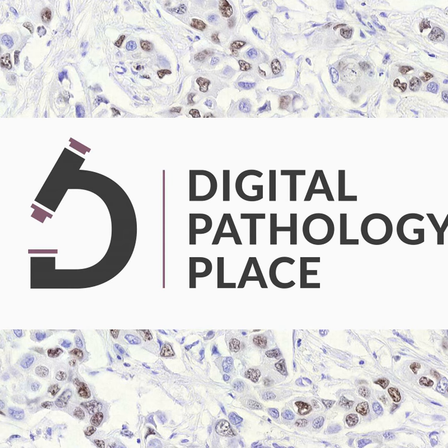So computer scientists who work in the field of digital pathology often find themselves frustrated when developing image analysis algorithms due to the numerous file formats that lack interoperability. Pathologists are similarly annoyed by this issue, with formats like JPEG, PNG, VSI, XML, NDPI, and CZI, just to mention a few, causing confusion and difficulties.